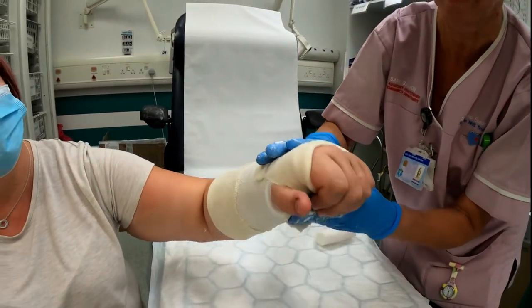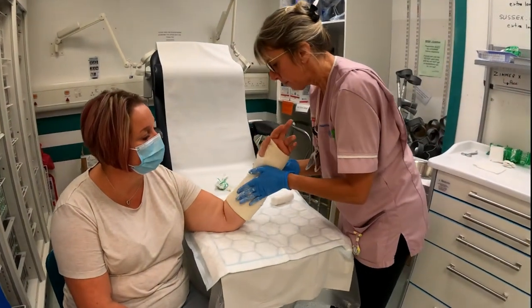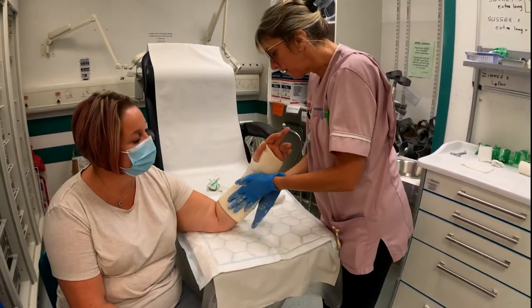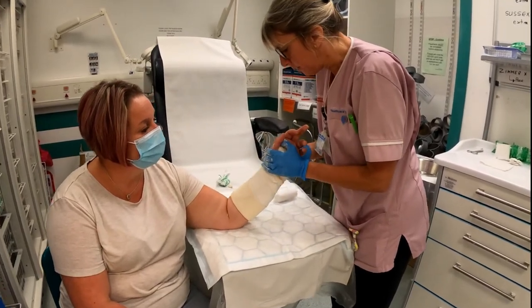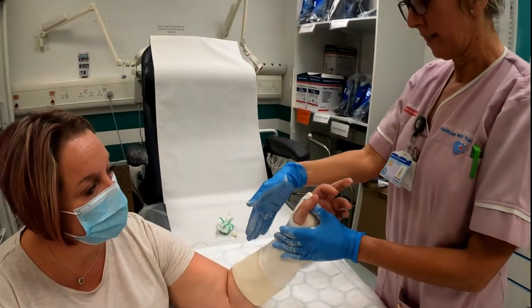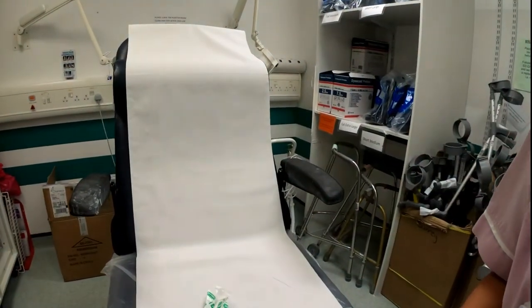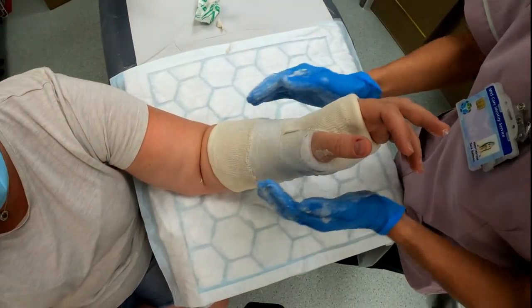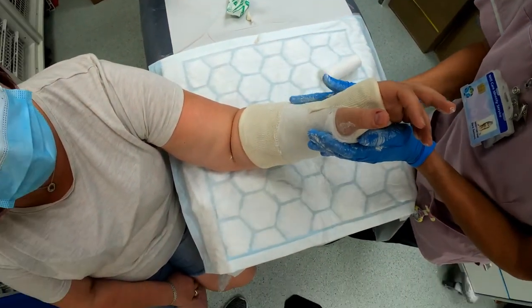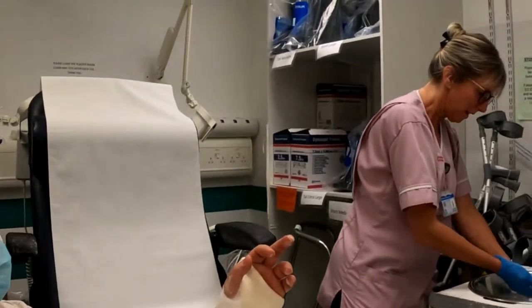When you bend your fingers, we can just see the knuckle line and the cast is free of the knuckles, giving lovely movement of the fingers. Make sure the cast is in a neutral position or with a very slight bit of extension, so looking down on it you can see it's straight in neutral alignment. We don't want any flexion of the wrist — a neutral line or even a tiny bit of extension. Wet your hands at this point otherwise the cast dries.